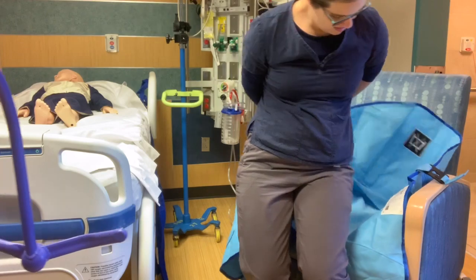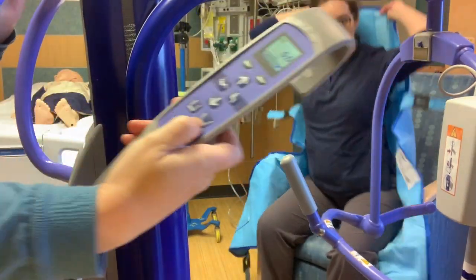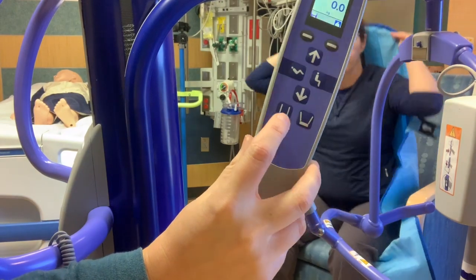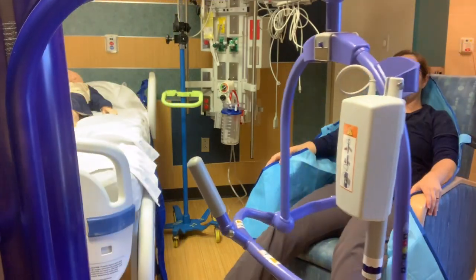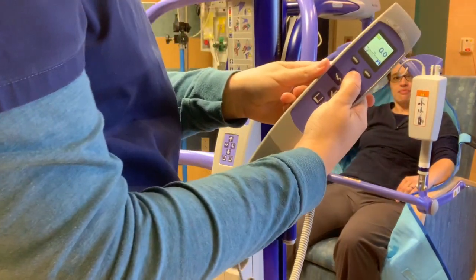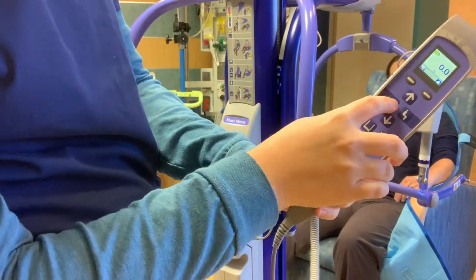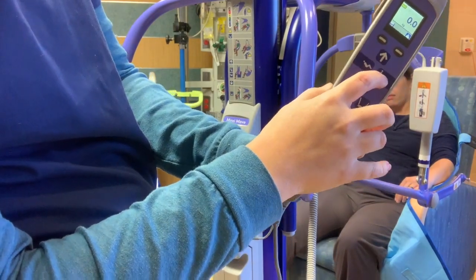While Christina's getting into the sling I'm going to roll the machine over. On the machine, if you need to spread the legs out around the chair, there's this button right here which will extend the legs at the base so the chair can maneuver a little bit better, and then this one would actually narrow the leg spread on the base of the machine. If you need to adjust it up or down to get it in position to hook your patient up, you can just push these arrows — this one will tilt the machine downwards and this one will tilt it upwards.